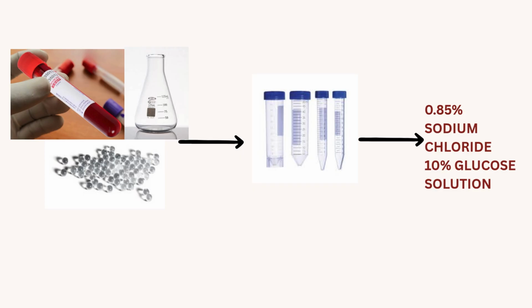So how do you defibrinate the patient's blood? So add 15 to 20 ml of whole blood to a 125 ml sterile Erlenmeyer flask containing 15 sterile glass beads. Gently rotate the flask until the hum or noise of the beads on the glass can no longer be heard. So that's about 10 minutes of gentle rotation.